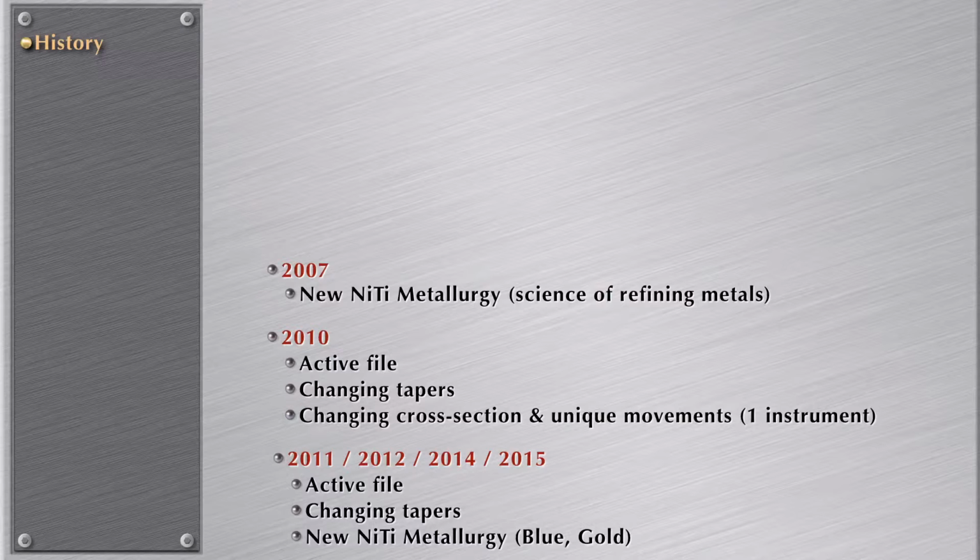Now we have different colors. We have blue, we have gold. That's why this presentation is the golden era of root canal instrumentation, or root canal reciprocating instrumentation.